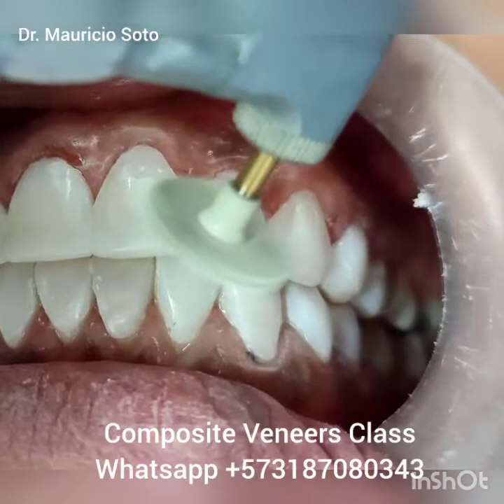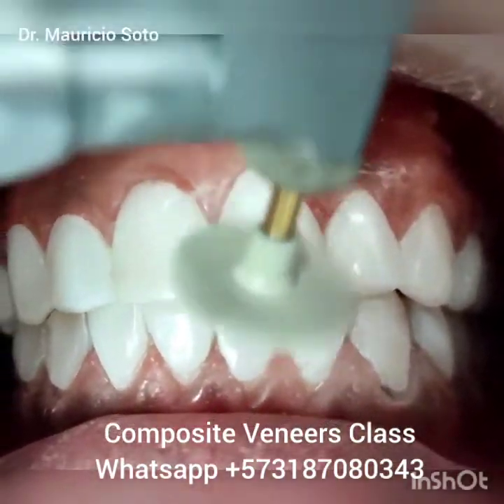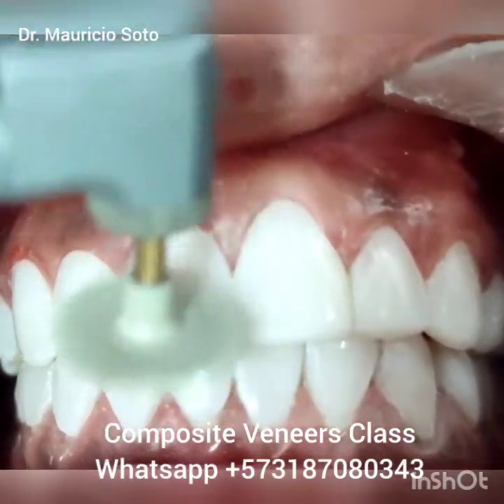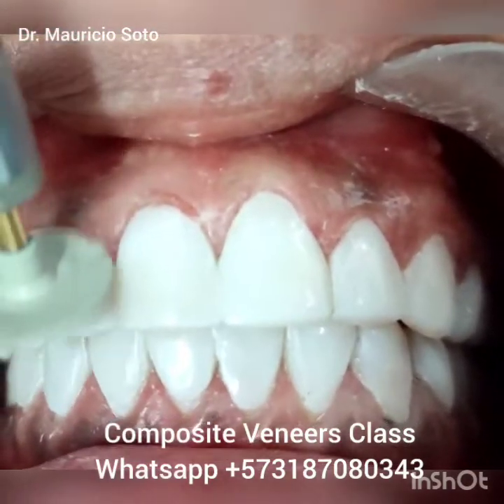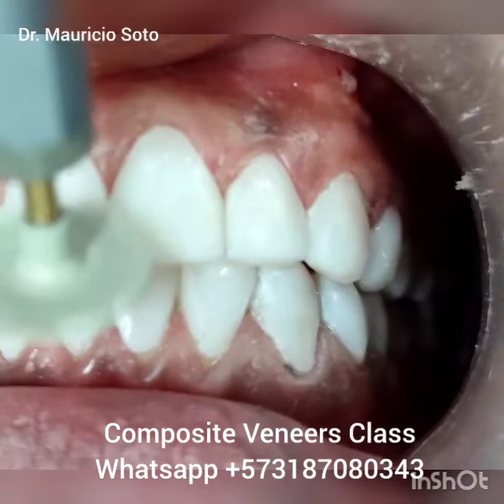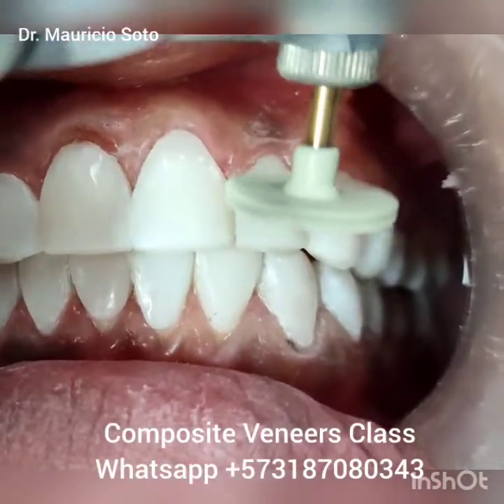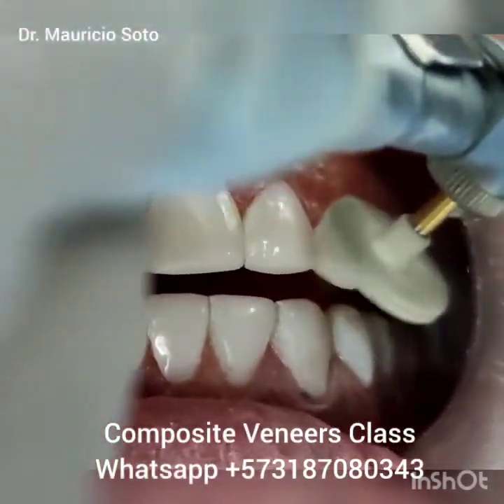I start to use the white wheel of the Eve Diacom system to obtain shine. First I use the pink, but I finish and obtain the shine with the white wheel. You can use it with water or without water. Spend 10 or 15 minutes to obtain a good shine.